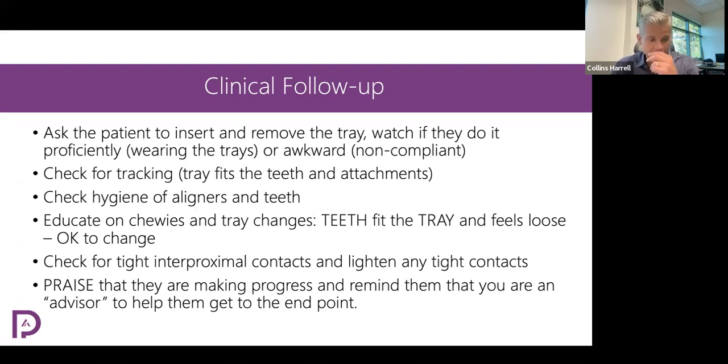So they come in wearing the aligner that they think they're finished with, and we're checking it in their mouth to make sure that it's fitting the teeth perfectly, that it fits over all the teeth, and fits over all the attachments without any little gaps or areas where you can see the tooth hasn't moved yet. Because it makes no sense to move on to your next aligner and hand out new aligners to the patient if we haven't completed the movements that were previously programmed to be done. So if there are little tracking problems, we have to figure out what we need to do to get them back on track. Okay, and there are lots of tips and tricks we'll talk about as we go through these webinars to address that. The first one for me, though, is to check to make sure that there's adequate space between the teeth.